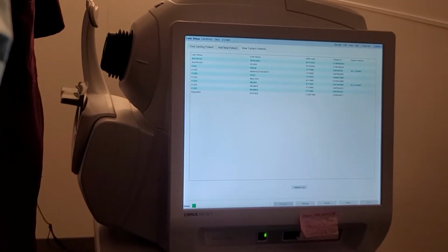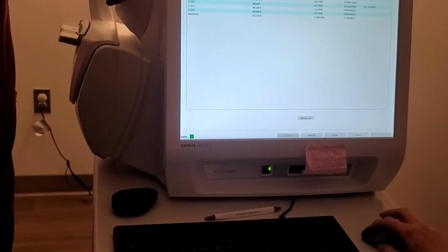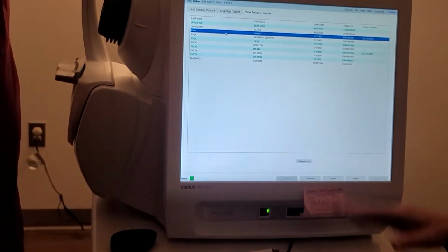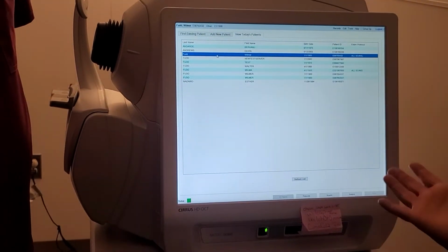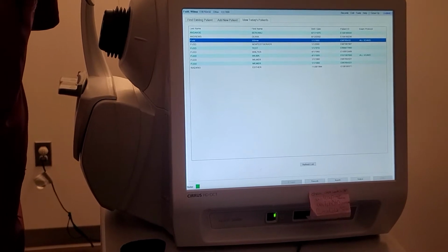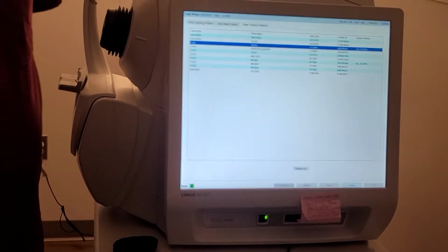Now I've acquired it, right? I want to analyze it, but I have to go find my person. So who was my person? Make sure you know who your person is, like your patient, right? Because we have a lot of the same names here, as popular as the Patels, the Smiths, or the Joneses, all kinds of different popular names. We would say they're coming out of the woodwork. Okay, now we're going to analyze.